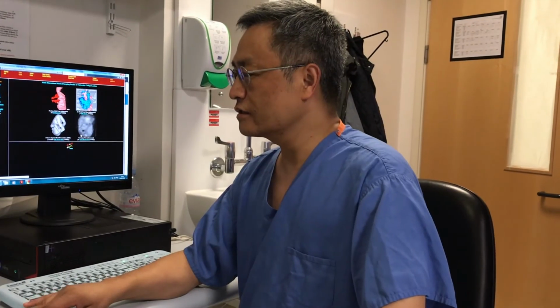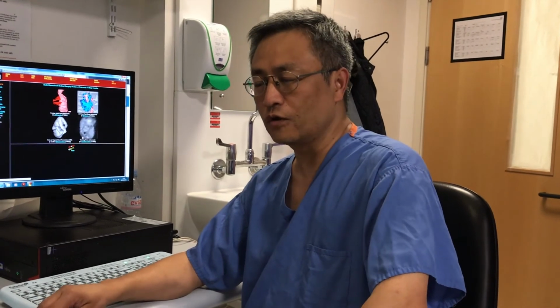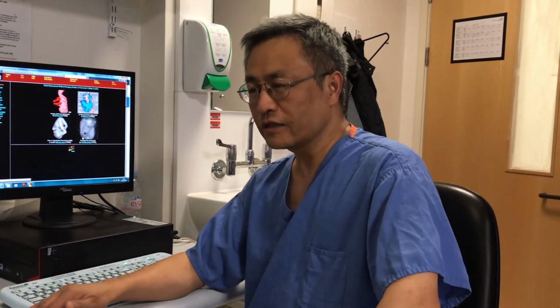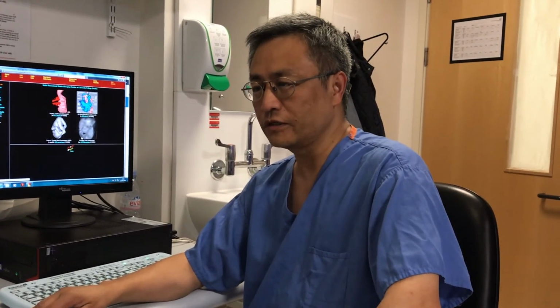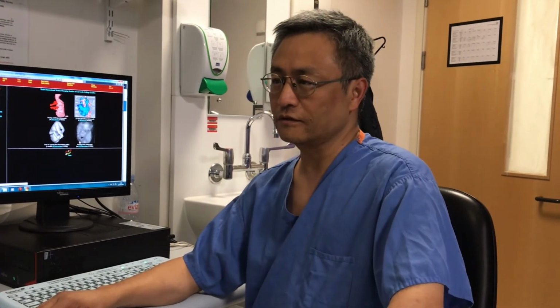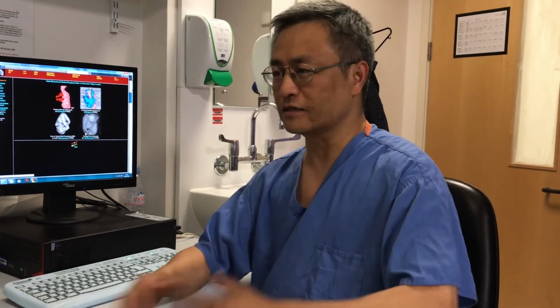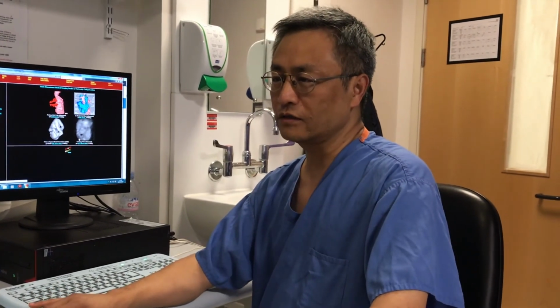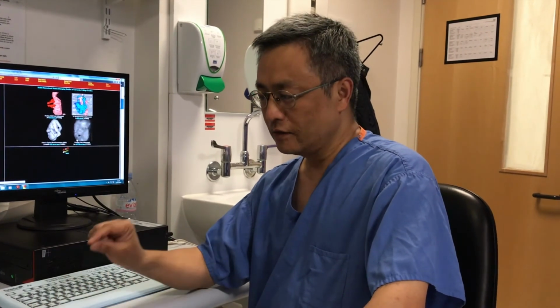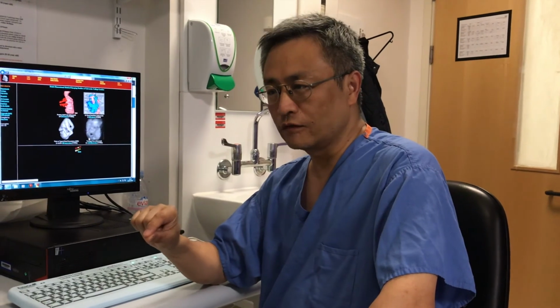My main interest is in the fetal heart. We have to find a way to remove motion artifact, because in adult studies you use ECG, but in the fetus you do not have ECG because the mother's ECG and the fetal ECG are mixed together. So we have to find a way to extract the time information from the fetal heart movement.